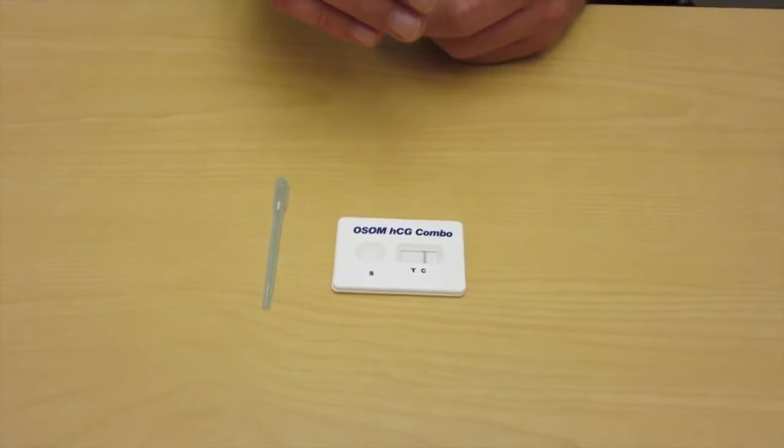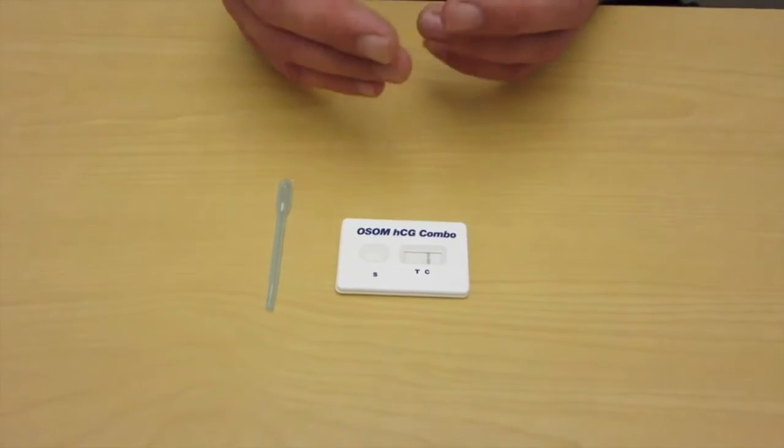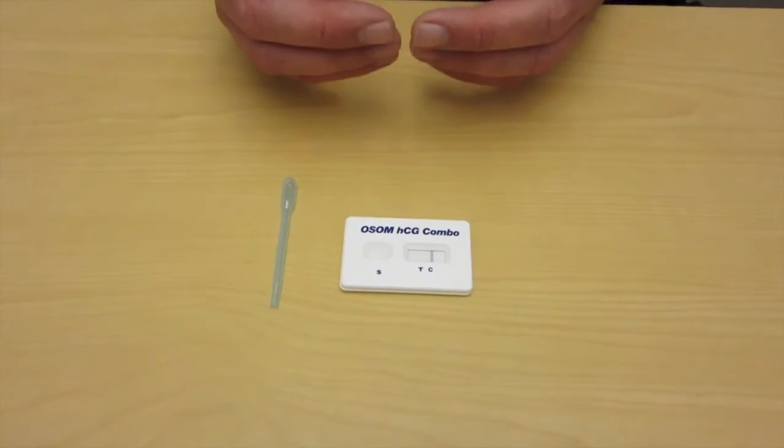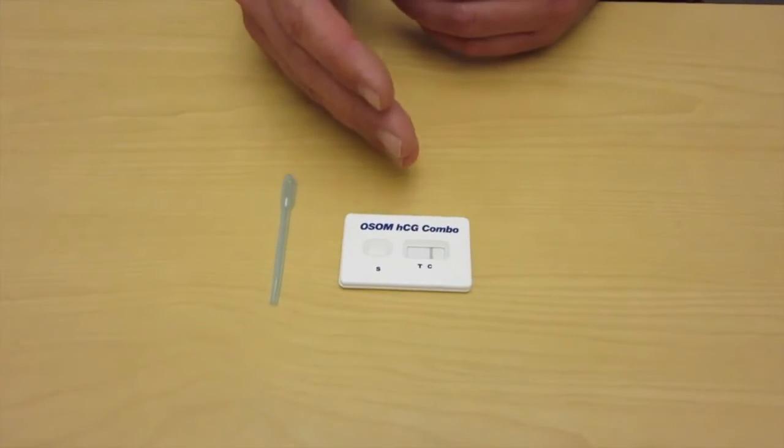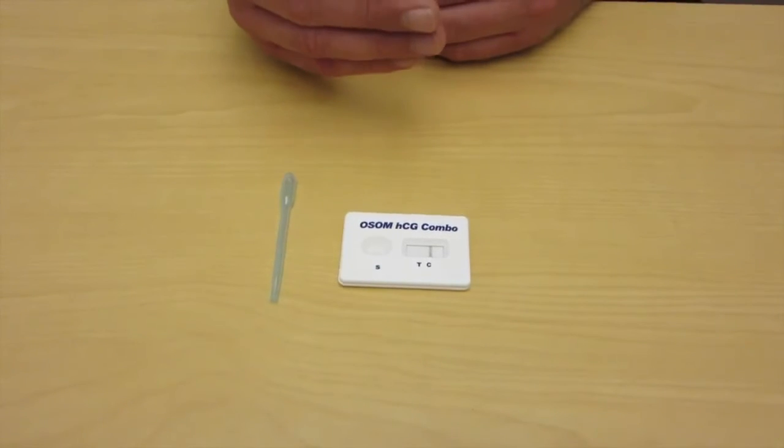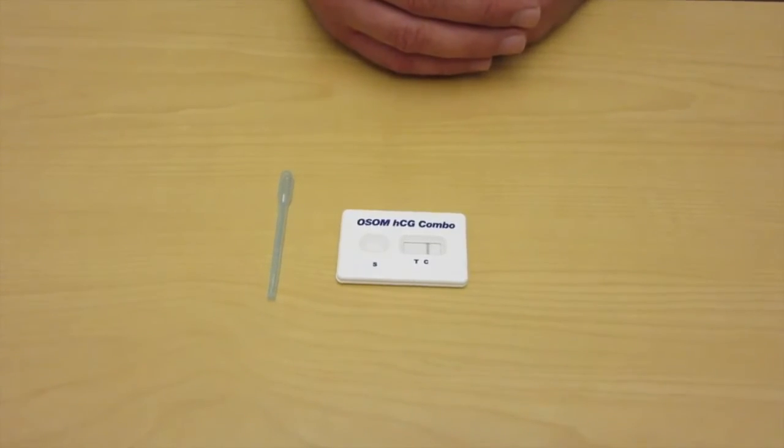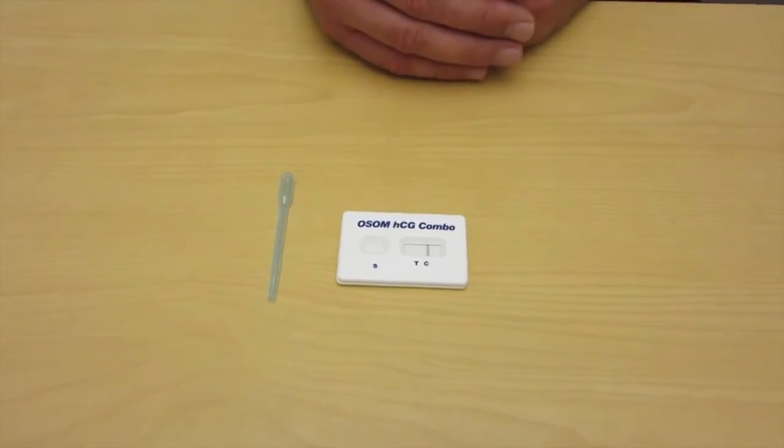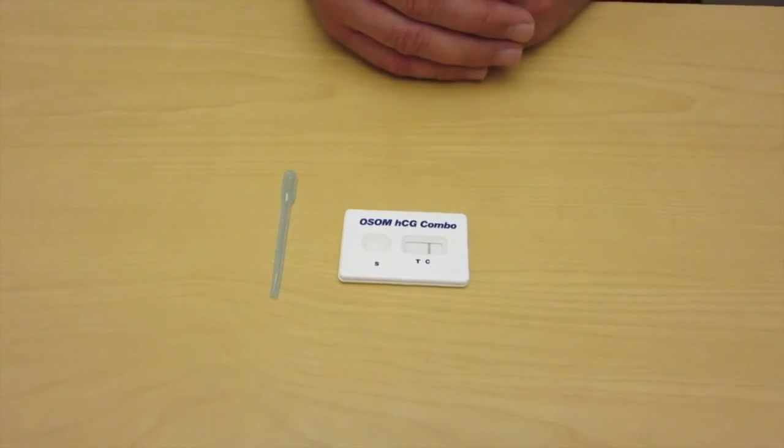Other things to consider here, if the urine is incredibly dilute, essentially clear as water, low specific gravity, you may not get a positive result even though they are pregnant. So always have an index of suspicion, and pull the trigger on the quantitative HCG if you feel like there's any reason to not trust the result that you're getting here. And that's it.